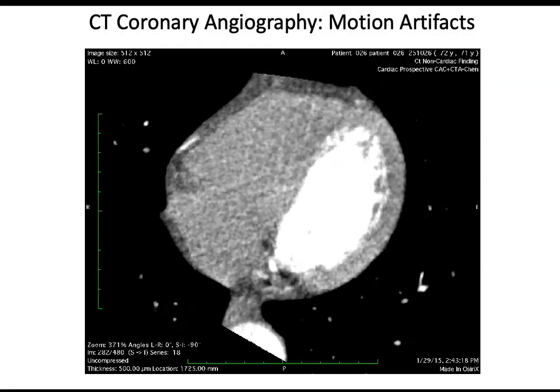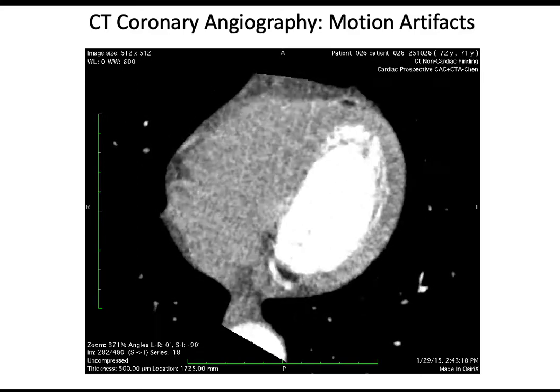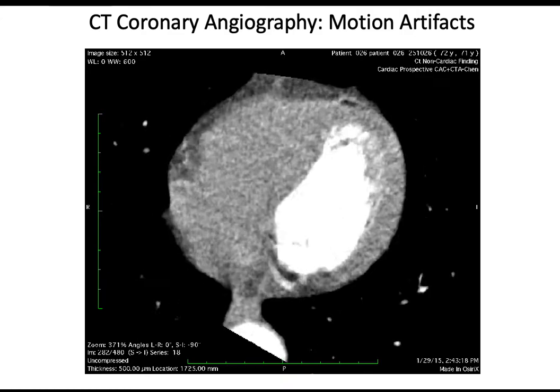All right, so now this is if you take a picture across the cardiac cycle. Let's say you make 20 pictures across the heart cycle. In reality, to make the coronary artery measurement, you just wanted one static picture when the heart was not moving at all. The point I want to make is that if this is your right coronary artery, sometimes you can tell whether it's open or not, and sometimes it's almost impossible to tell where it is at all.